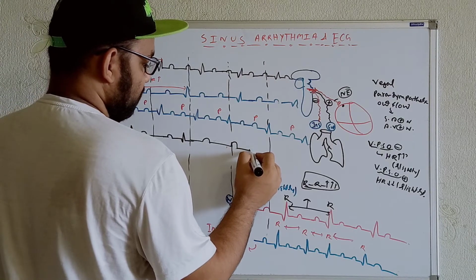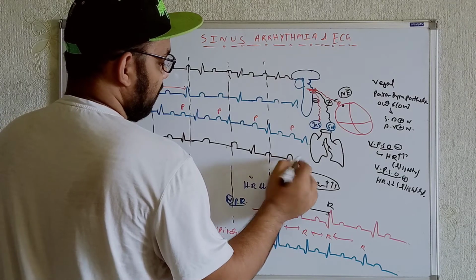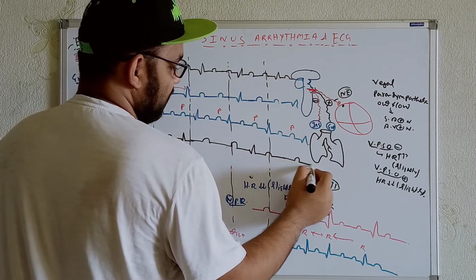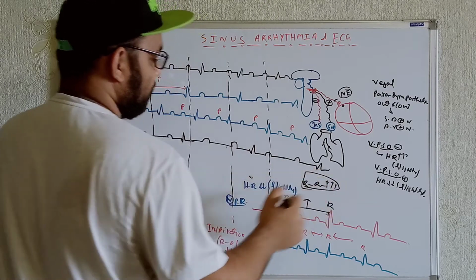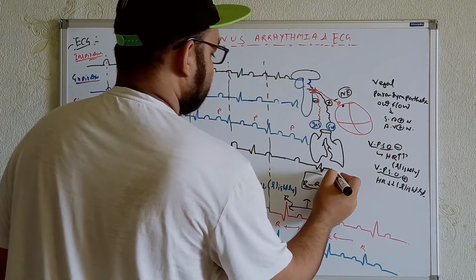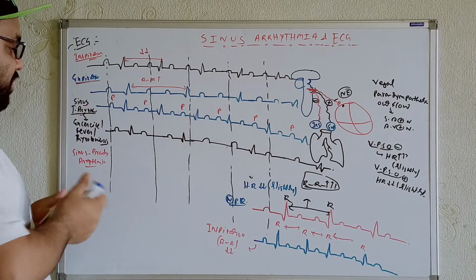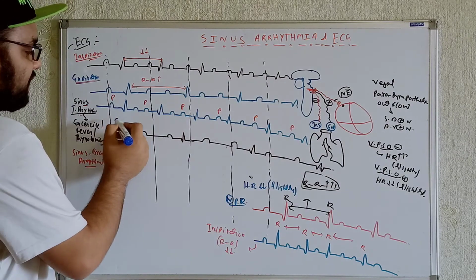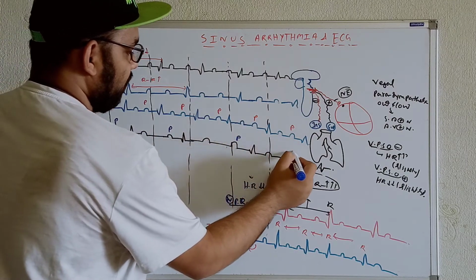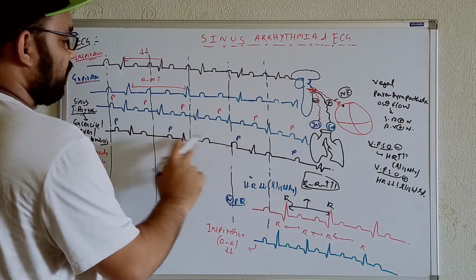Okay, let me show over here: QRS complex, T wave. Again we are getting the P wave in these conditions, then again the QRS complex for this one. Now try to understand from here that when you are talking in terms of sinus bradyarrhythmia, in these cases we will get very few P waves. P wave 1, P wave 2, here we got 3, here we got 4. In these cases we got 1, 2, 3, 4, 5, 6. In these cases we are getting, for example, 1, 2, 3, 4.